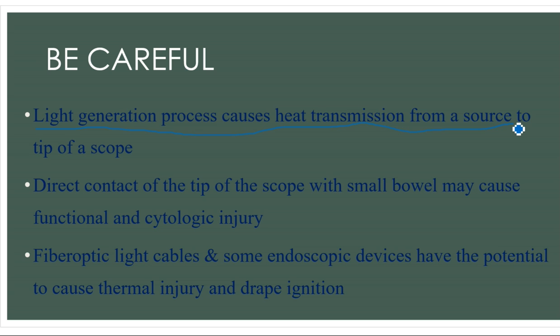Whenever the image is blurred, just take the laparoscope outside and clean the tip of the laparoscope with hot water, right? Just clean the lens outside, instead of cleaning it inside the patient's abdomen against other internal organs, right? Then fiber optic light cables and some other endoscopic devices, remember they always have the potential to cause thermal injury and sometimes even drape ignition. The drapes may catch fire while operating.